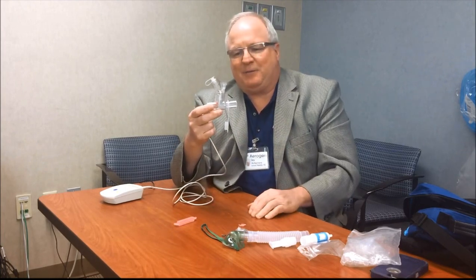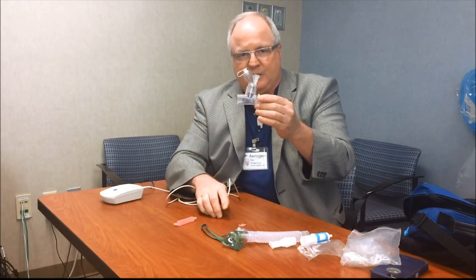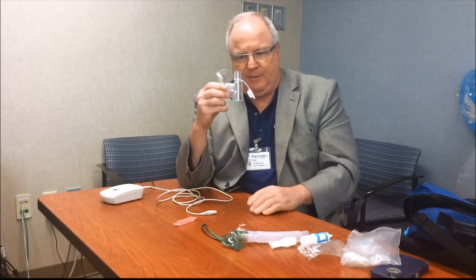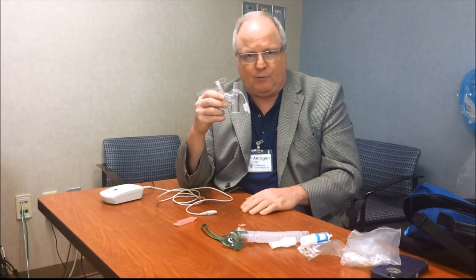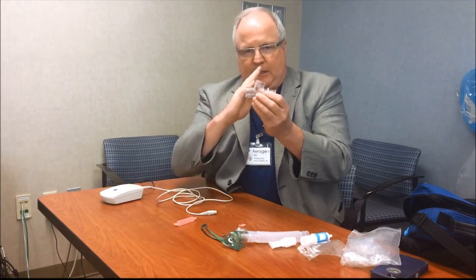But I got ahead of myself a little bit. I'd like to explain the best positioning for this. So once you have this in the circuit, whether it's in this position or you have it in this position in another modality, either a mask or however else you determine to use it, you'll notice that the T-piece has a slight angle to it.